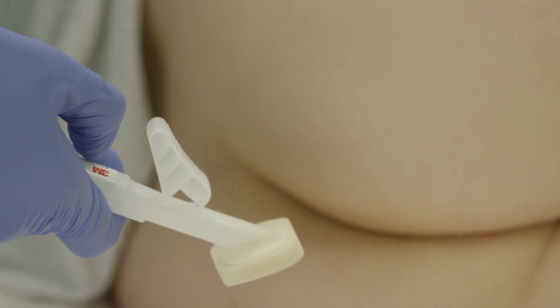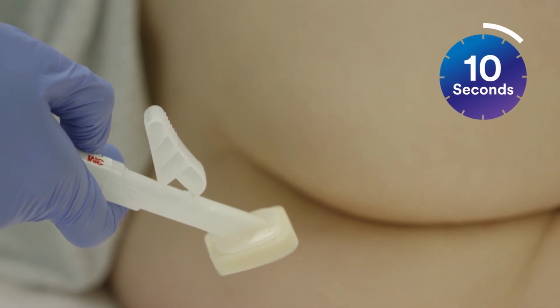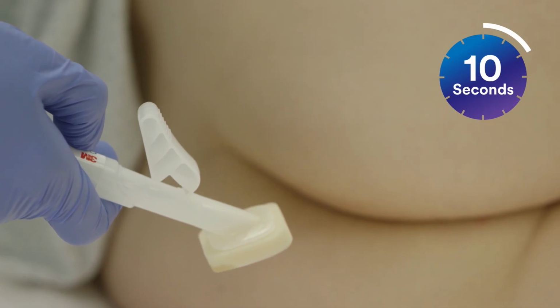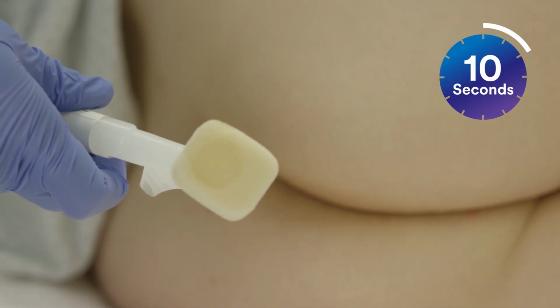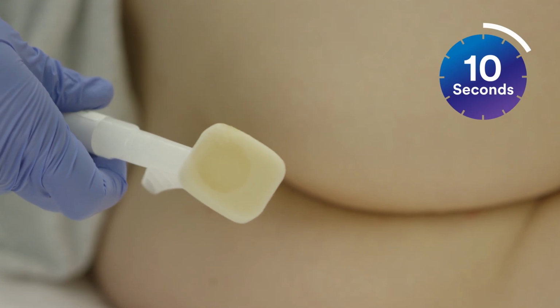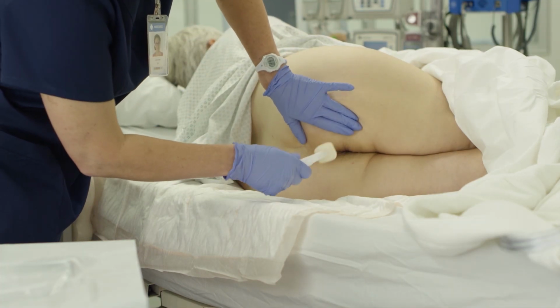Keep the applicator pointed in a downward position for approximately 10 seconds to allow fluid to flow into the foam sponge. The fluid flows by gravity, so it's not necessary to maintain pressure on the lever. Notice that it's normal for the fluid to not completely saturate the foam sponge all the way to the edges. Now you're ready to apply 3M Cavilon Advanced Skin Protectant.